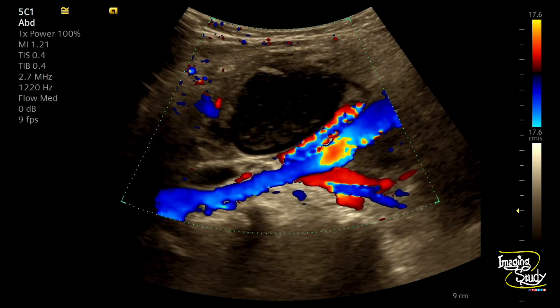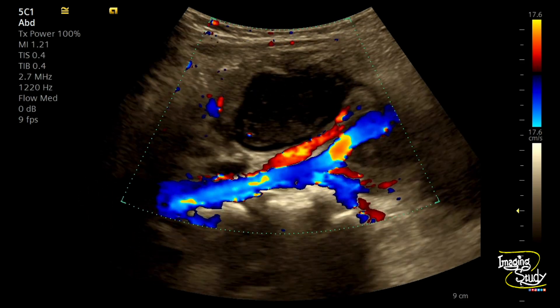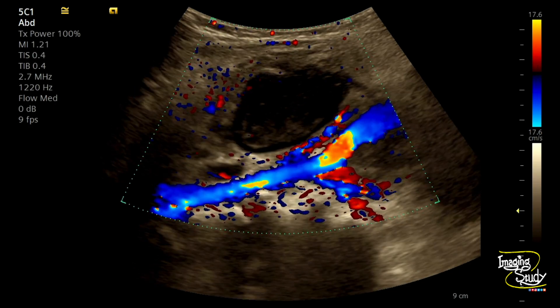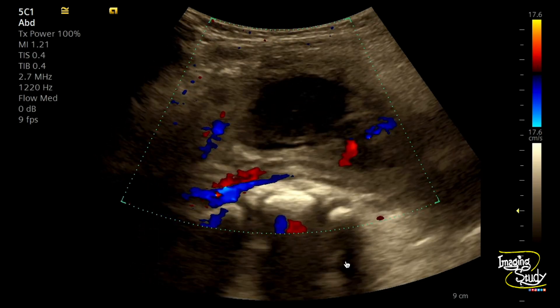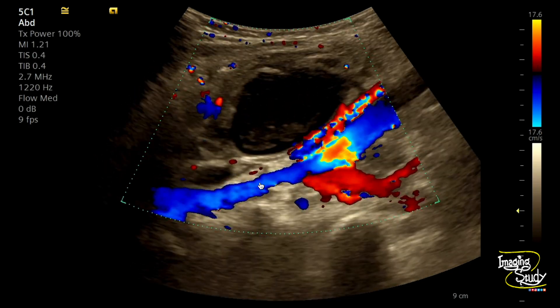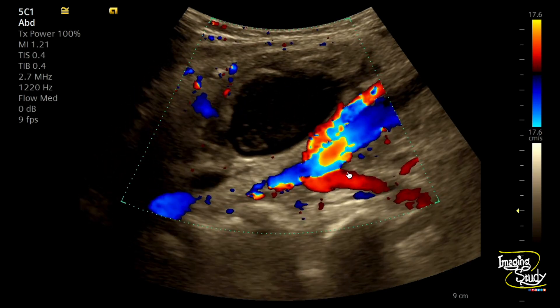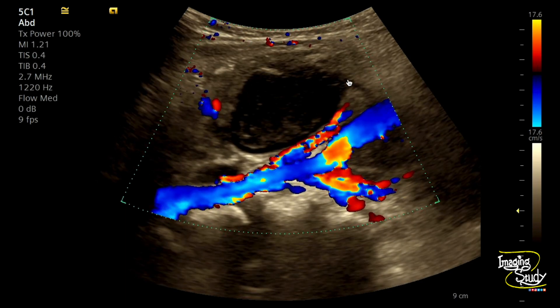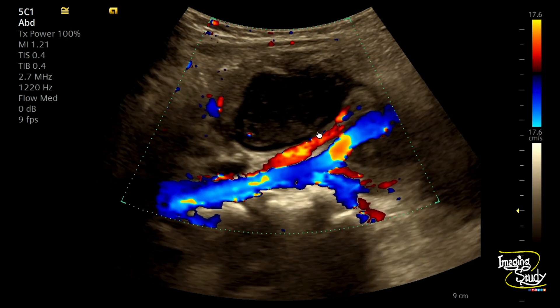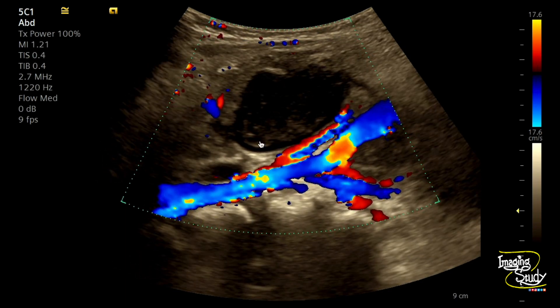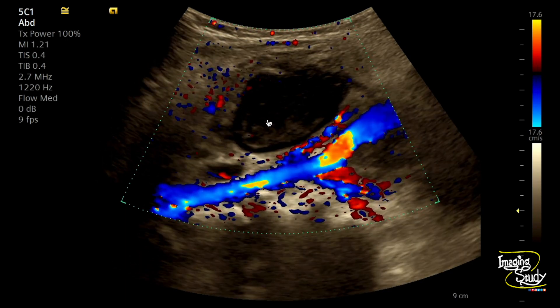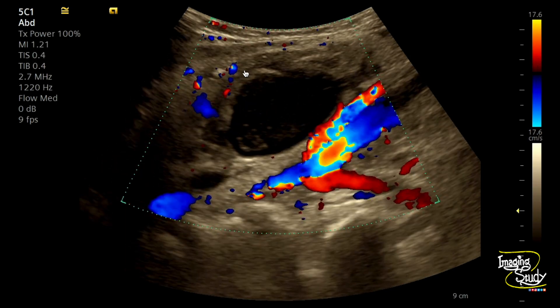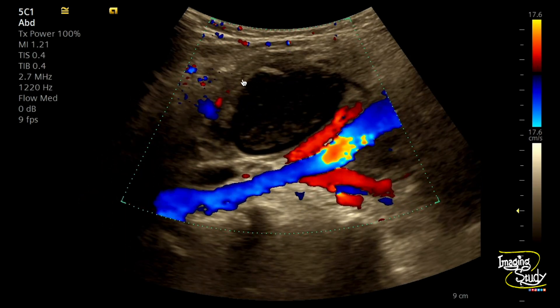Let's apply some color Doppler. Here's a low-frequency ultrasound picture. You can see the iliac vessels, and adjacent to these vessels you can see the lesion with no internal vascularity. However, you can see prominent peripheral vascularity due to the inflammatory process.